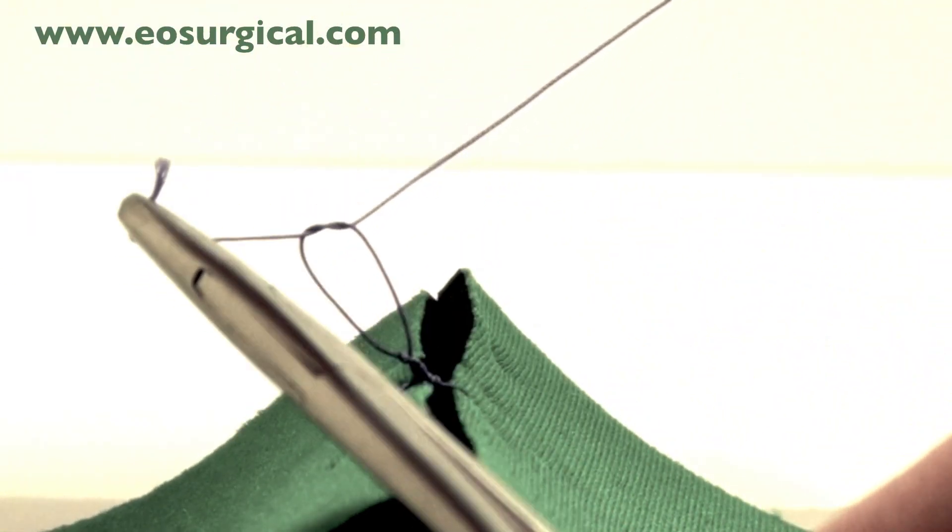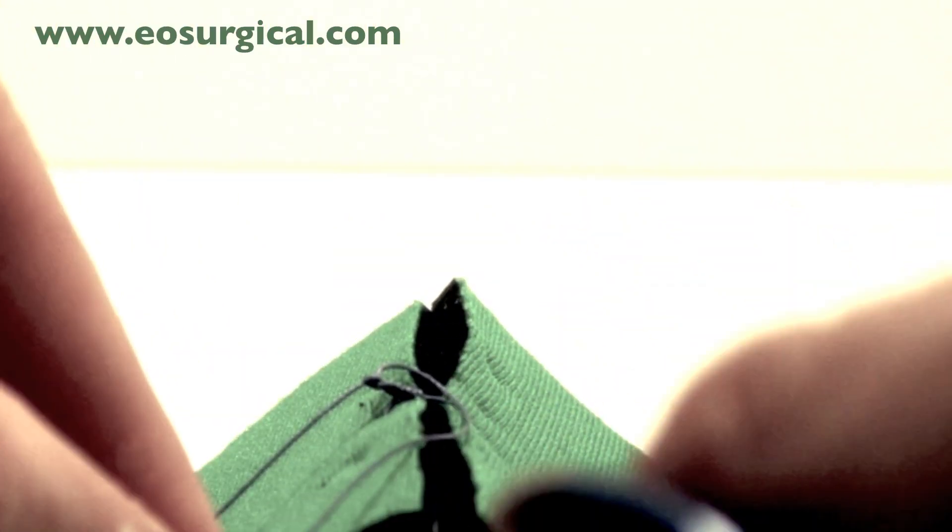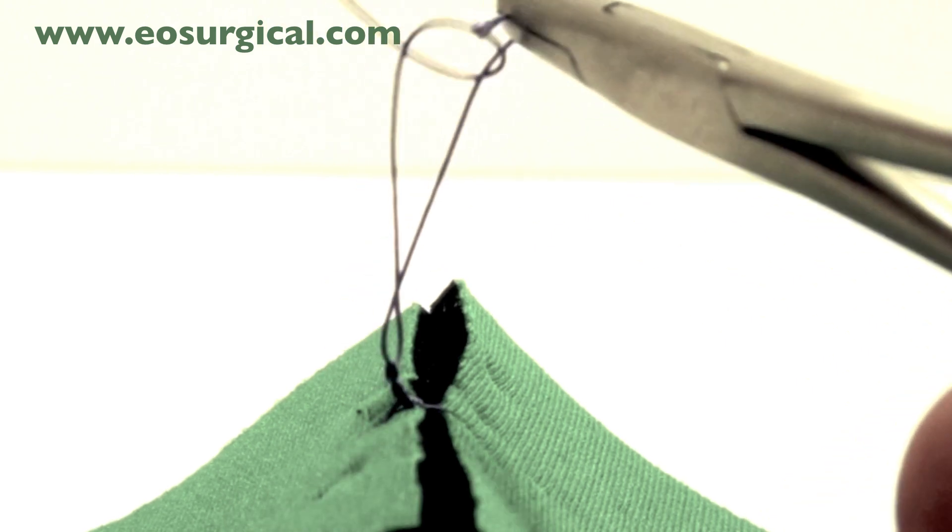Again, it's important to note that the hands are crossing to ensure that these knots are lying flat. You're holding it from left to right and then from right to left.